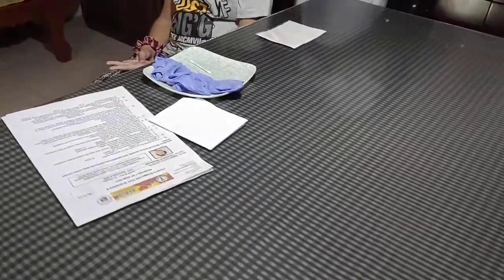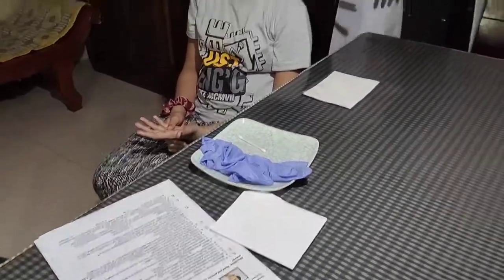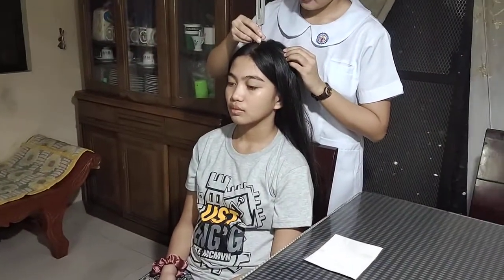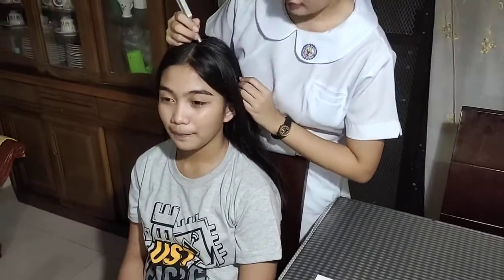So we will now use the tuning fork. We will now place the tuning fork on the client's scalp. You will just pound it. So, Ma'am, did you hear any sound? Yes. Okay, Ma'am. So, thank you, Ma'am.